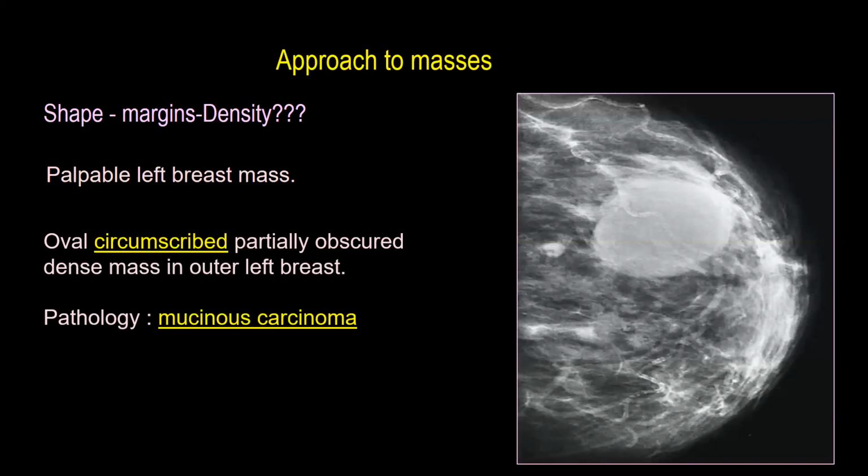We mentioned that 1.4% of circumscribed mass margins include the mucinous. Remember 4 M's of the circumscribed margin: the mucinous, medullary, metastasis, malignant phyllodes. These are 4. Then the papillary, which is the other specified type.